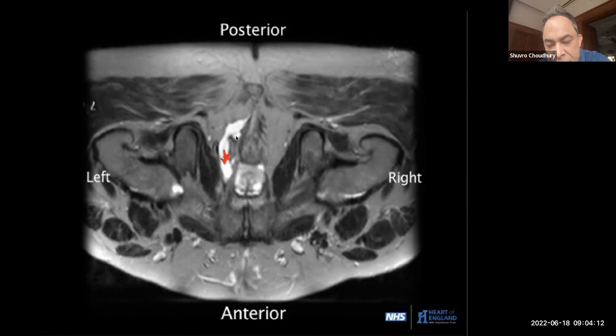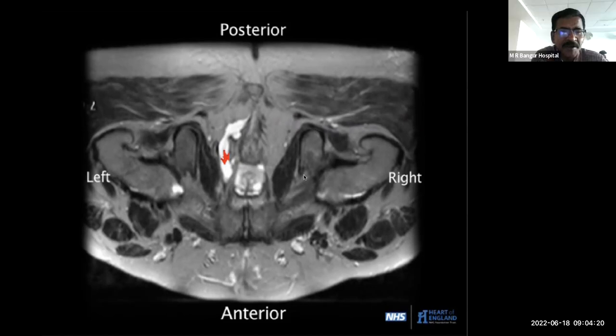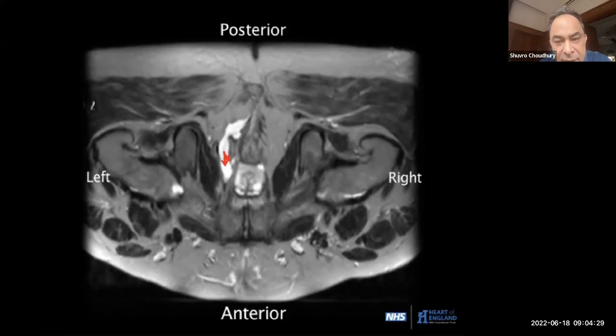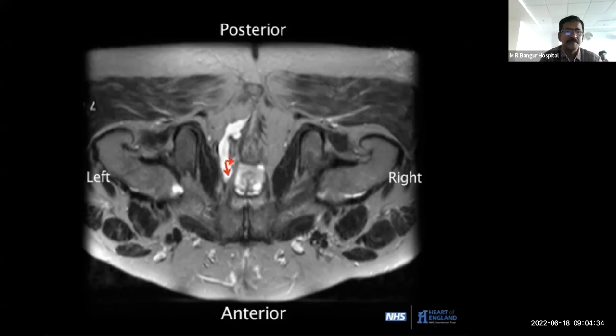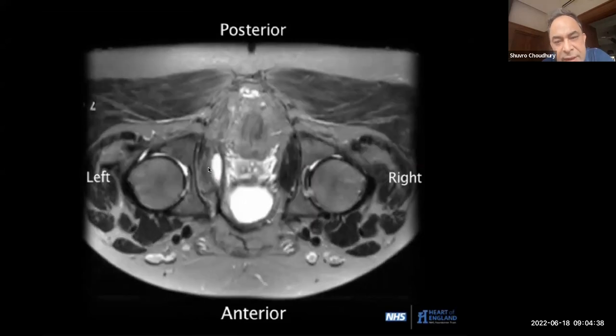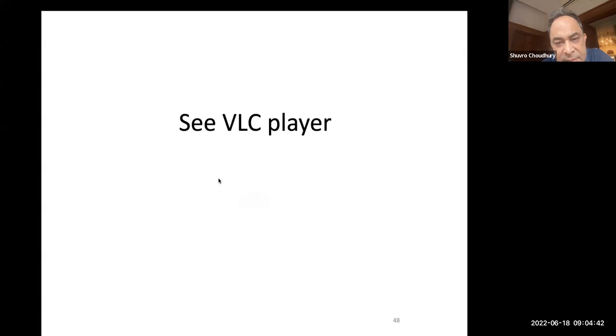So this, if I drew a coronal picture, would be something like this. Are these two muscles levator on either side? Yes, either side muscles are levator. This one is partly the levator, partly also the obturator internus. Let me see what else is there in this talk. Oh, so this is going further up. You can see this is the very large tract abscess.